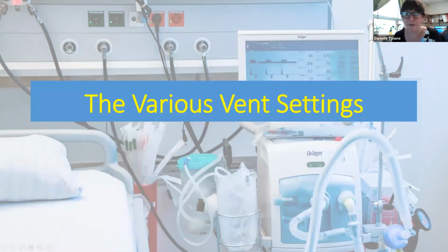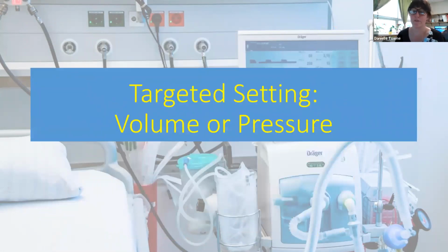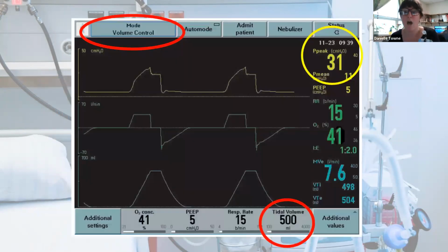What about all of the different various vent settings that we have to choose from? So the first thing we're going to talk about is the targeted setting. That's how the ventilator measures and delivers breaths. There are two targeted settings that you could set on your ventilator, either volume or pressure. A volume targeted setting is being measured by exactly that, volume. The ventilator will fill the lungs with a set amount of volume that you program into the ventilator.